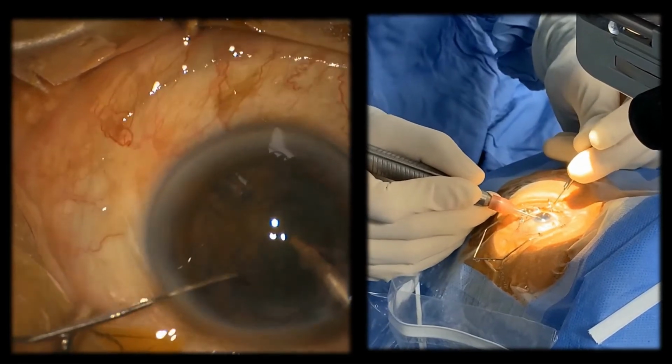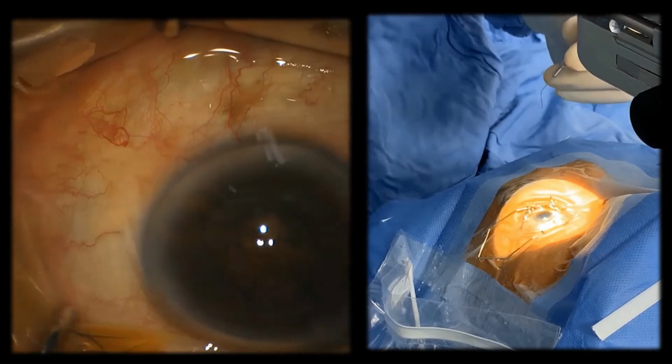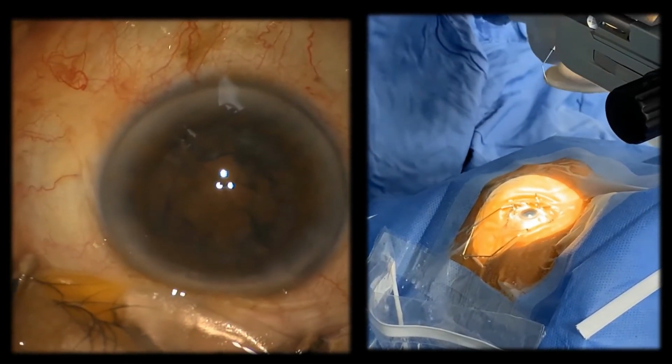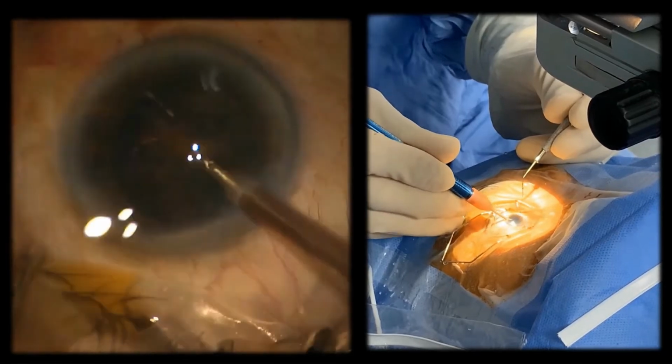It is important to avoid pressing on the speculum, which will exert undue pressure on the eyeball during the procedure.